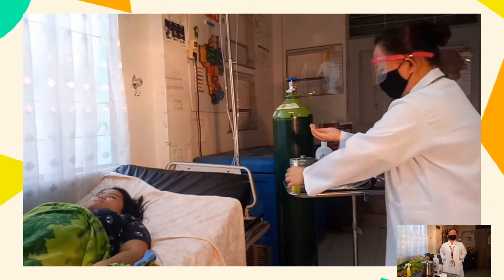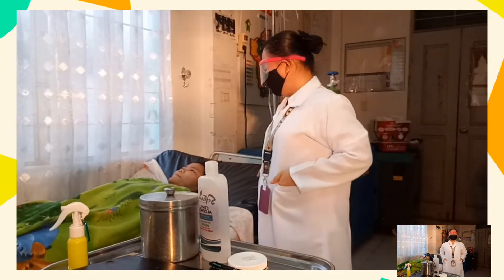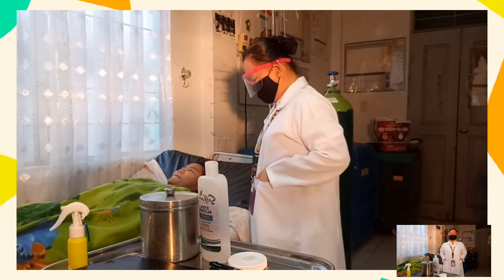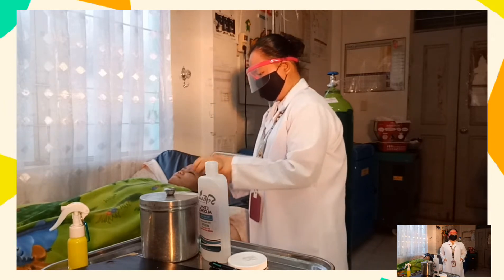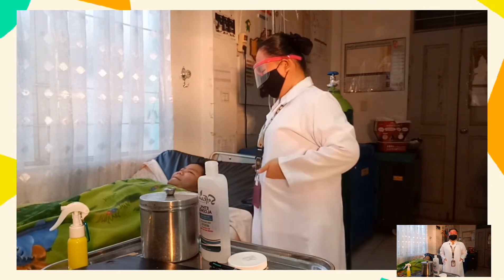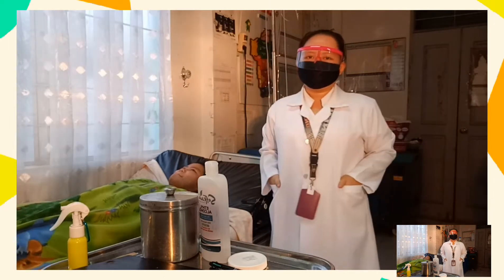Identify the patient, close the curtains around the bed, and close the door to the room if possible. Next, explain what you are going to do and the reason for doing this to the patient. Review safety precautions as necessary when oxygen is in use.